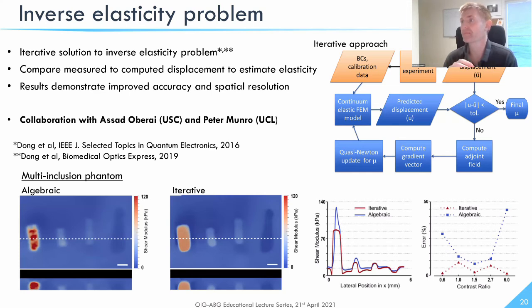If we're talking about mechanobiology, where we've got relatively uniform hydrogels with cells which the stiffness is on the same order of magnitude normally as the gel, I think it can be well posed, and we can get accurate solutions, so not introduce more inaccuracies. But that's to be determined.